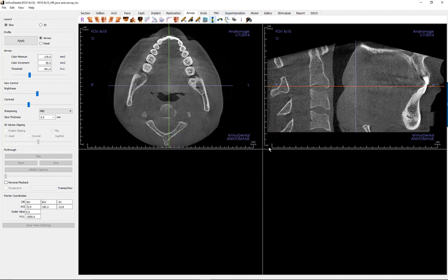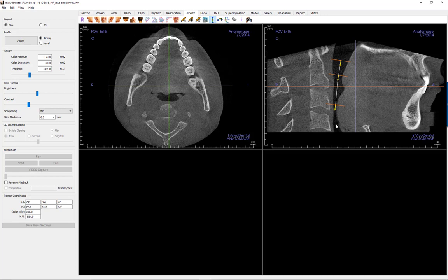By placing points along the segmented airway, a minimum area and volume is computed, as well as the anterior, posterior, and right and left distances.